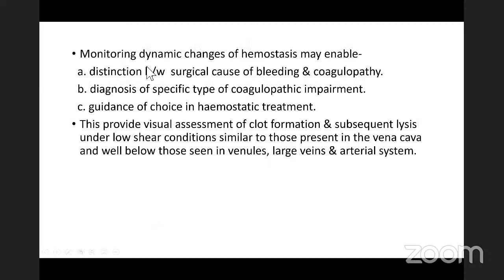Coming to the monitoring of dynamic changes of hemostasis, this may be enabled by TEG. Distinction between surgical causes of bleeding and coagulopathy, diagnosis of the specific type of coagulopathic impairment is seen in TEG, and guidance of choice in hemostatic treatment is helpful. TEG is helpful in guidance of choice.